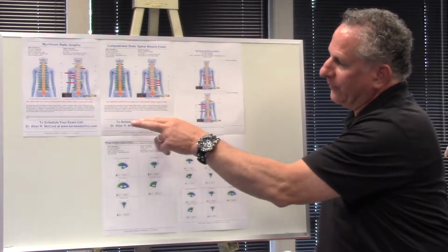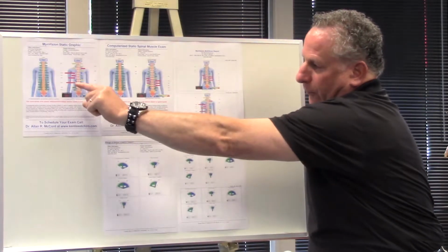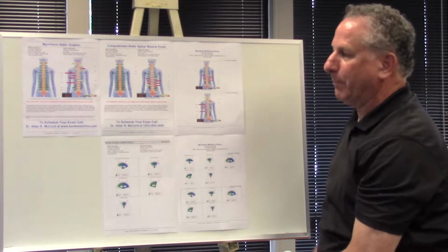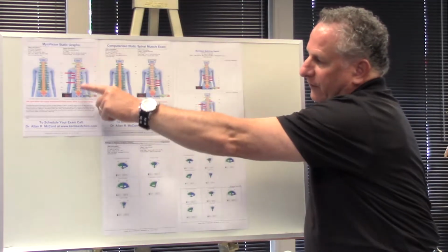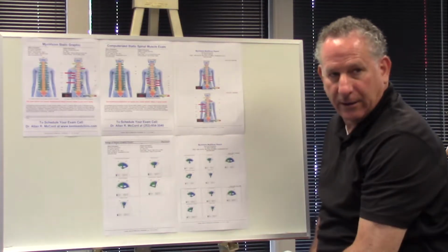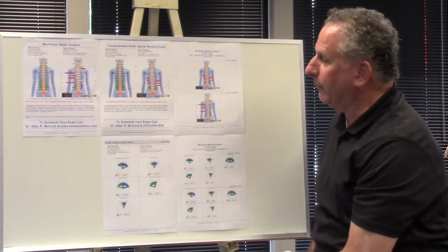So what you're seeing up here on this board is an initial test. You can see the ideal, listed in the green bars, and you want balance, that's what that's showing. Of course, you can see the model of the spine there. If the spine is balanced and working correctly, you're going to see green readings. And over here on this side was the actual test of that patient, where you see not only some green, but then some yellows and definitely some red bars, with the reds being longer and yellows being more moderate. That's showing the higher levels or moderate levels of muscle tension.